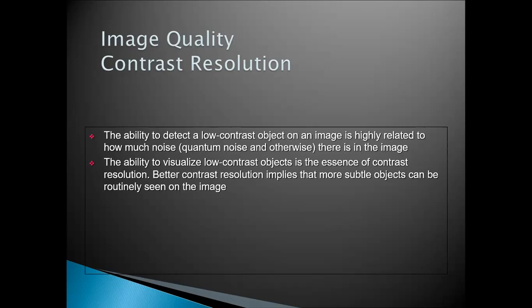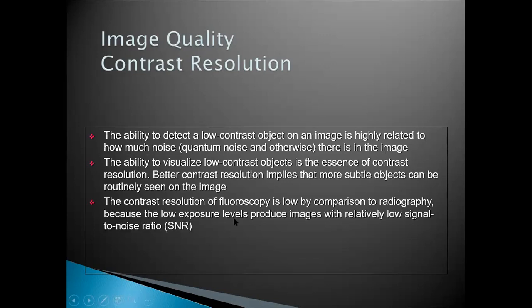So better resolution implies that more subtle objects can be routinely seen on an image.